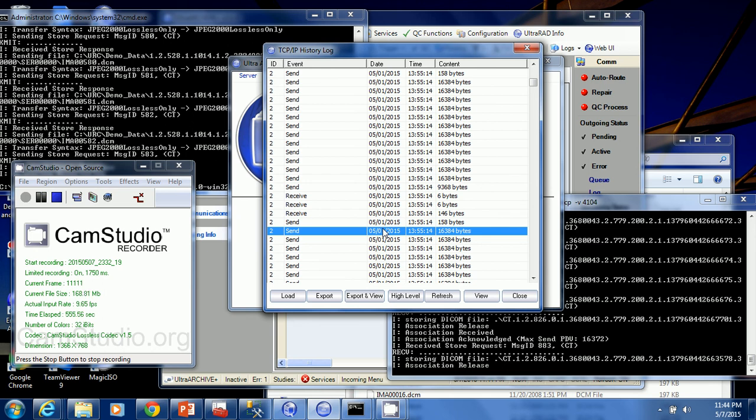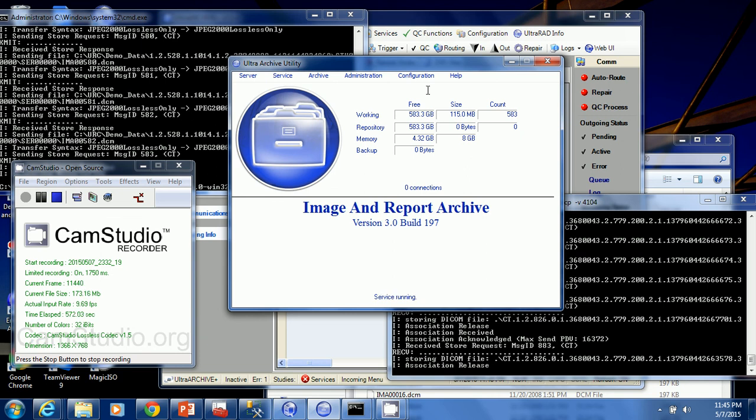This is a DICOM routing product. It's all about DICOM integration, and in many cases we are interfacing to systems that maybe don't have very robust logging. So we have to do a tremendous amount of logging so that we know exactly what's going on on both sides to make sure everything's working right. So in any event, this is how the routing basically works.